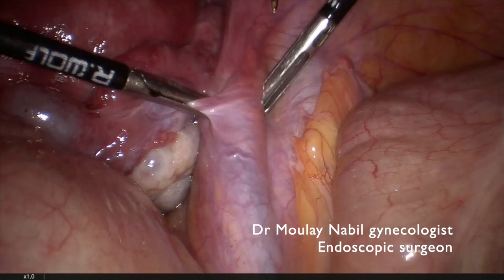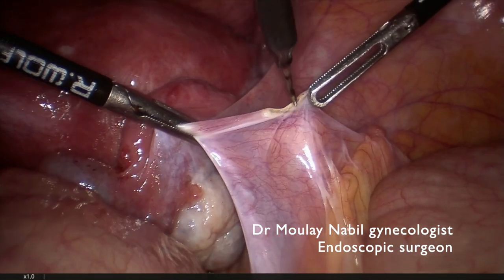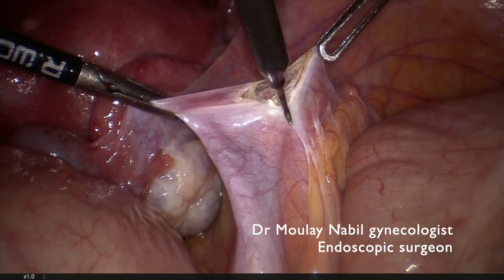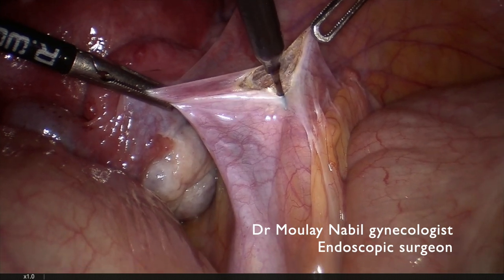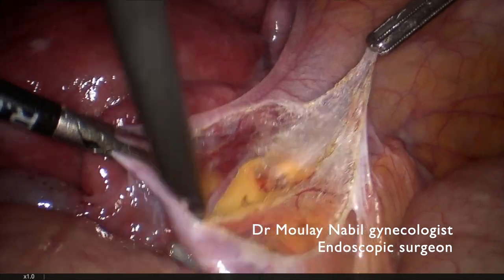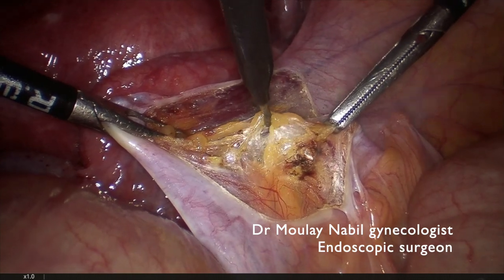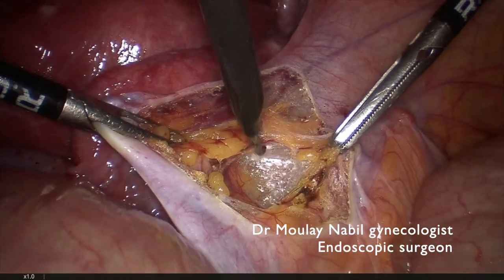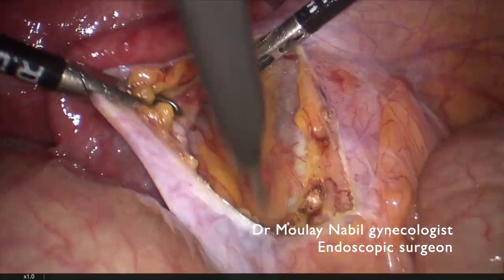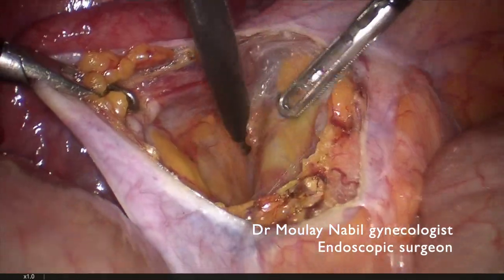We will do the same on the right side. We open the peritoneum lateral to the infundibulopelvic ligament — we can use the harmonic or the monopolar needle in section current. After grasping and pulling the right ligament, we develop the retroperitoneal space, which is an avascular space, and we try to find our classical landmarks, which are medially the ureter.